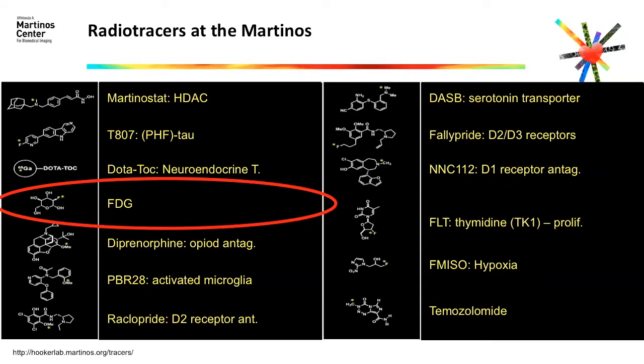As I was saying before, I'm using cardiovascular applications as my main target for clinical applications. And for those, I will show you a couple of examples at the end of this talk on how we can use different tracers that are not targeting any of the brain receptors, like most of us are doing at the Martinos right now.